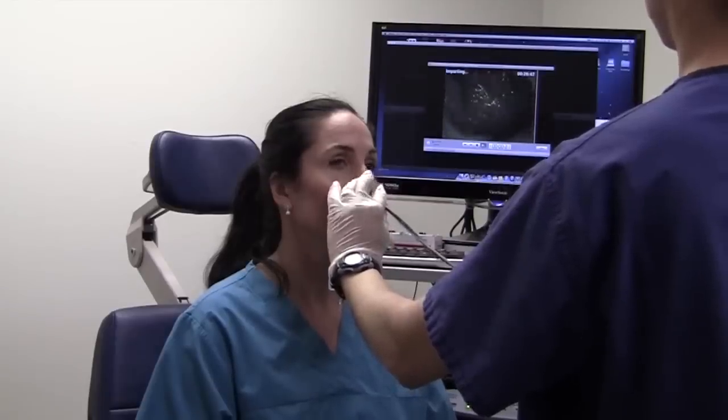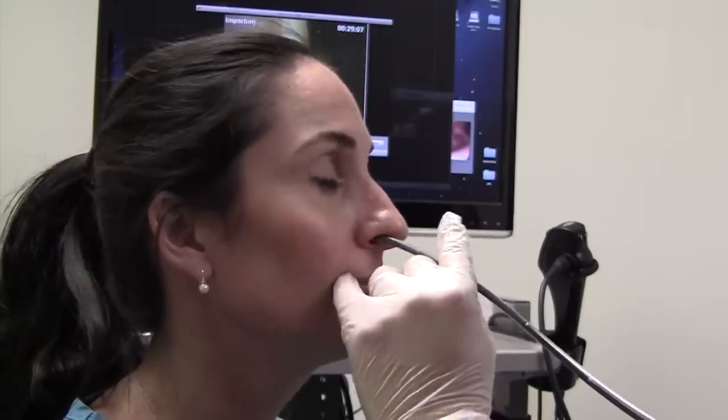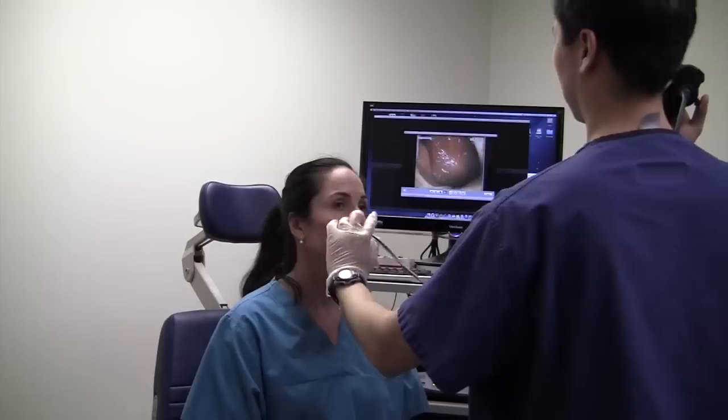Here the scope is passed gently and slowly through the nose. Once the back is reached, it is guided down into the throat.